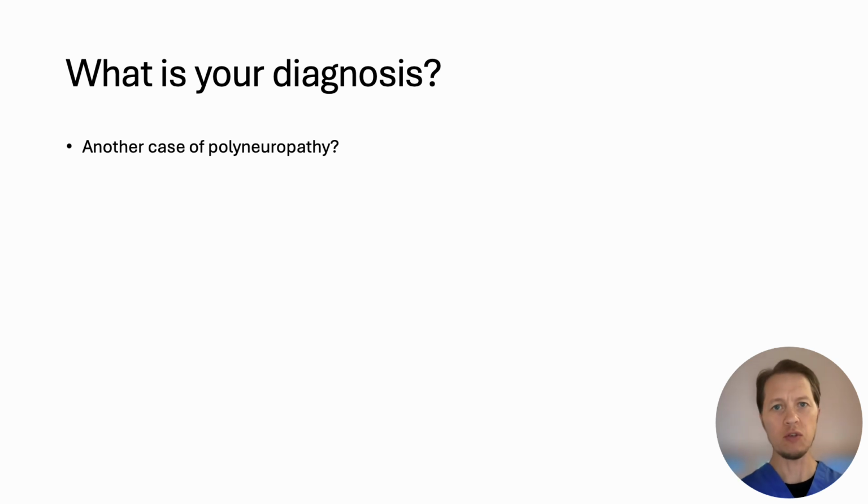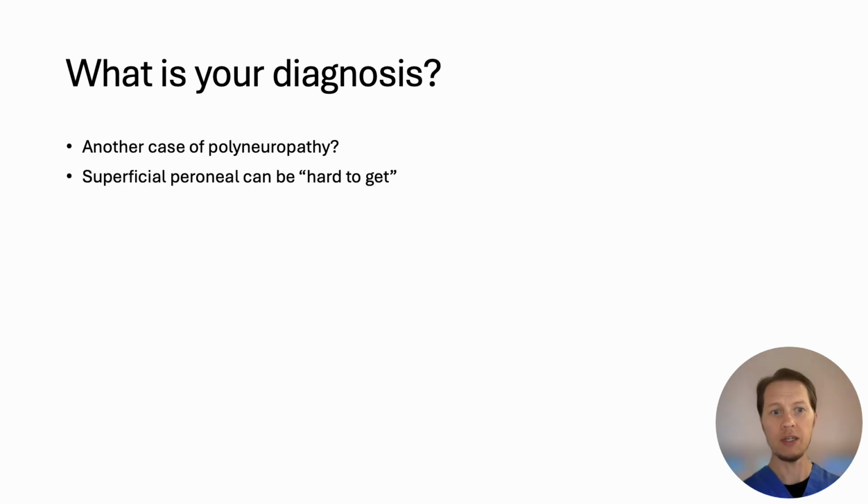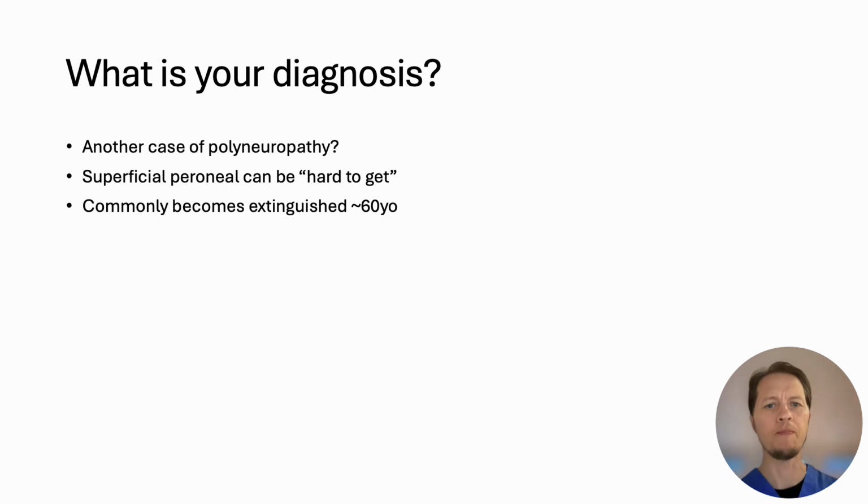Well, it could be. No response to superficial peroneal, right? That's actually kind of a technically hard one. For those of you who are learning EMG, it can be technically difficult to get. It is certainly something you have to practice at, but you'd be surprised, you can find them more often than not. You don't want to just go straight to technically difficult, could not obtain.